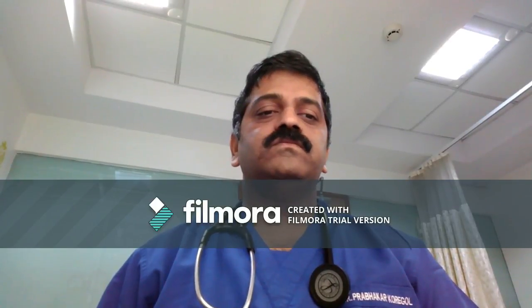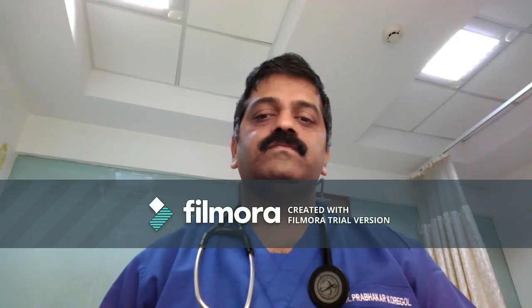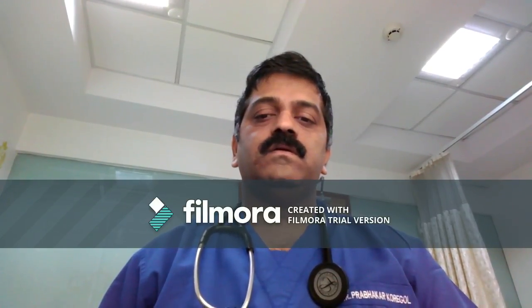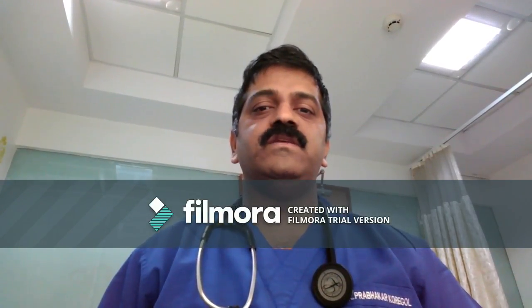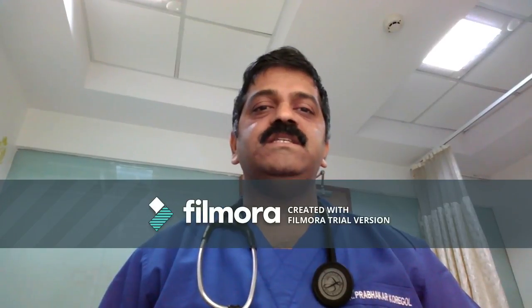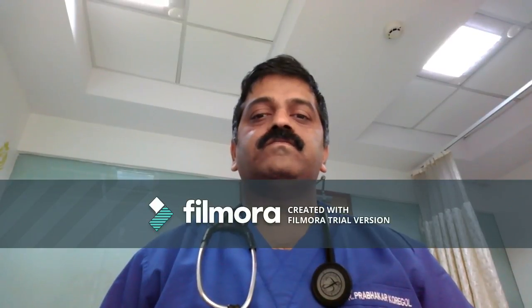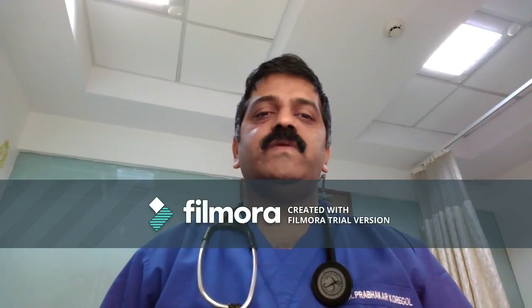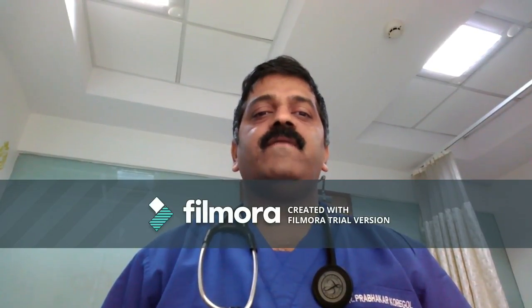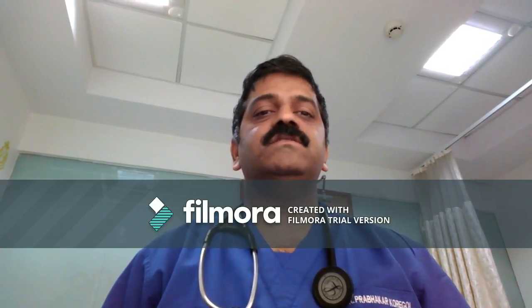What do you need to look at when we talk about the ischemia or infarction? We need to focus mainly on the ST segment and the T wave inversions. So when we talk about the ischemia, there will be ST depressions along with the T wave inversions. And there are different kinds of ST depressions which you will master by looking at the different ECGs.